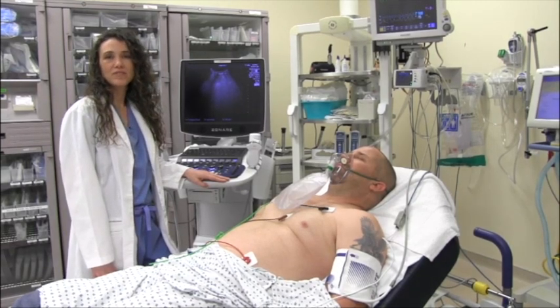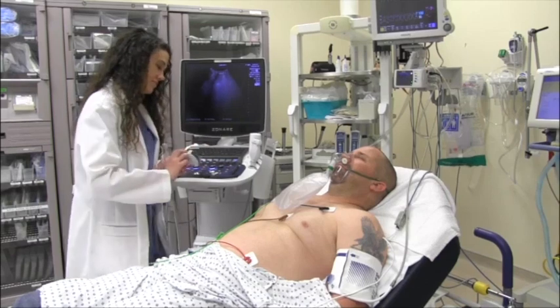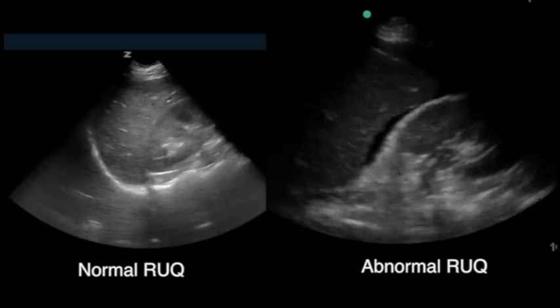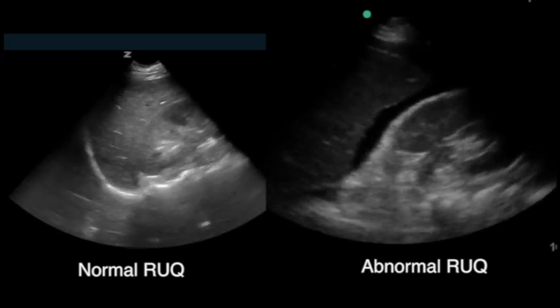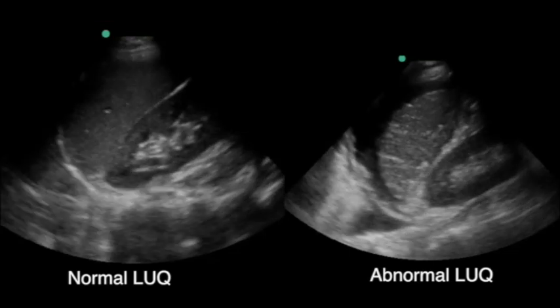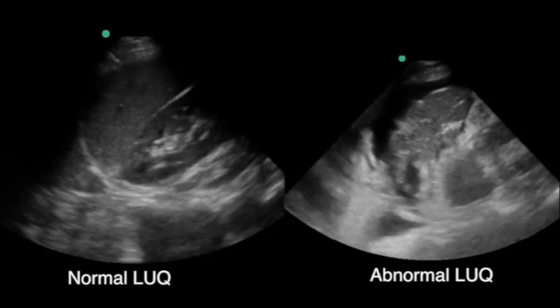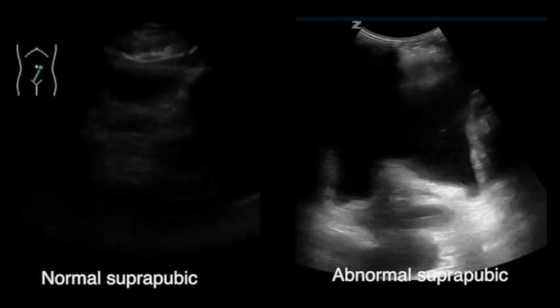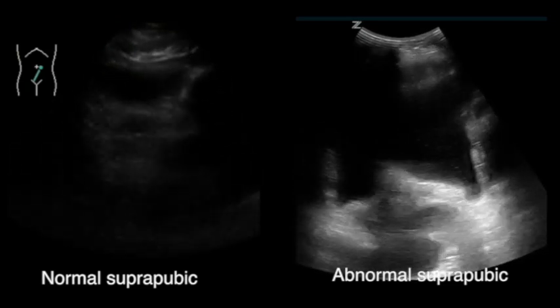The next step of the exam is to do the 3 traditional intra-abdominal views of the FAST exam. We will now compare normal and pathologic views. Here is a normal view of the right upper quadrant and a video showing free fluid between the liver and the kidney. This is a normal video of the left upper quadrant compared to a view with free fluid around the dome of the spleen. We see a normal transverse suprapubic view and a video with a large amount of free pelvic fluid. You can see the uterus surrounded by fluid.